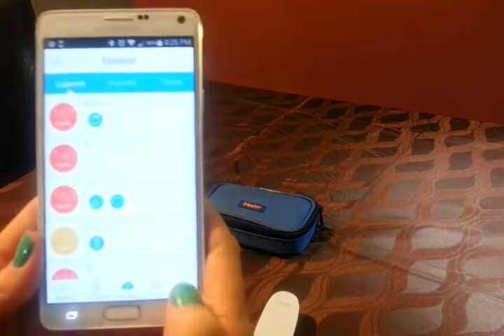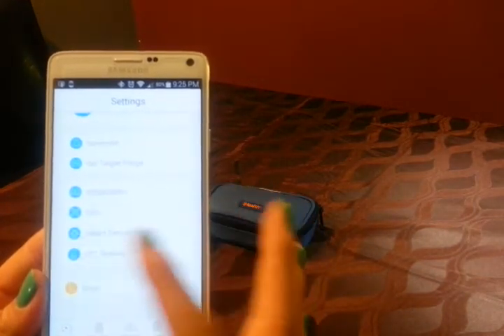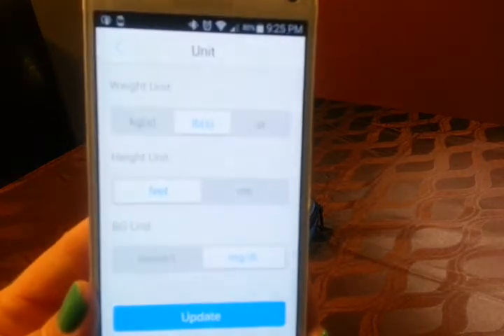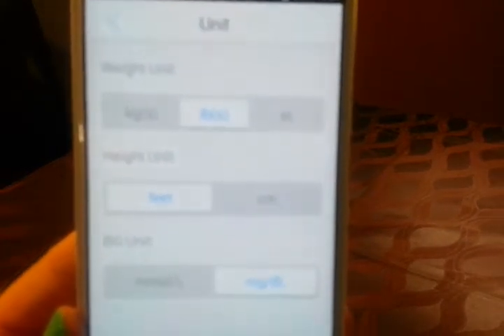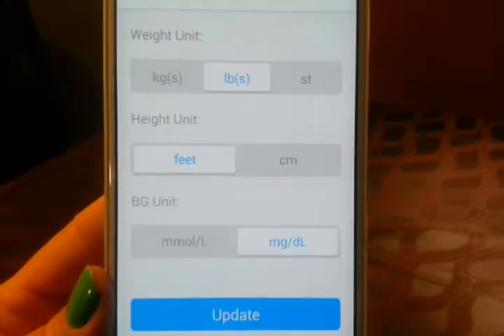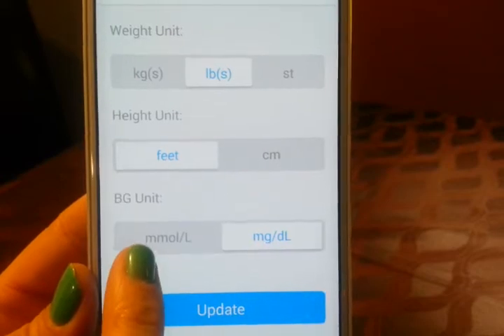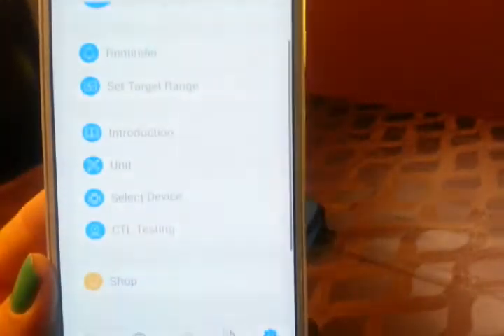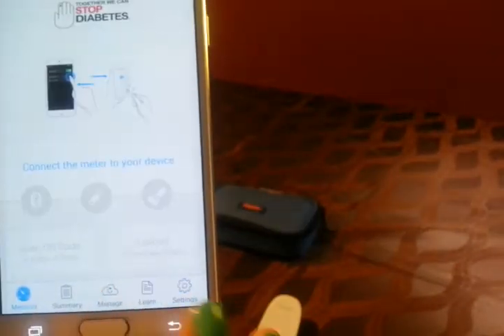In the settings you can set reminders and target range. You can choose pounds or kilograms, feet or centimeters, MMOL or milligrams per deciliter. And then you can put all your information in there.